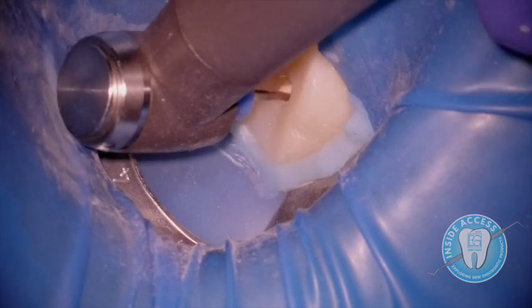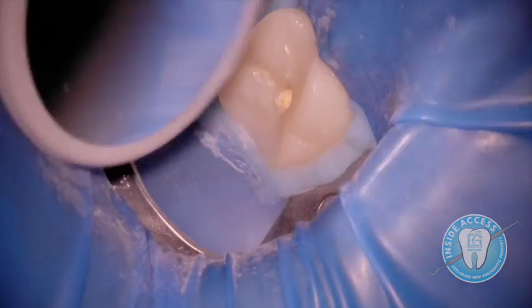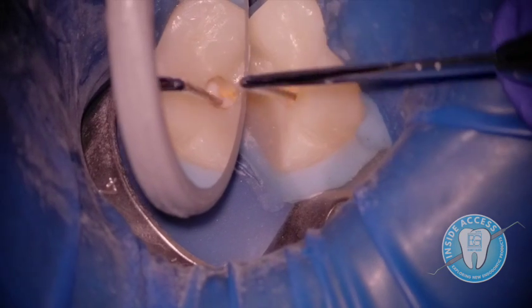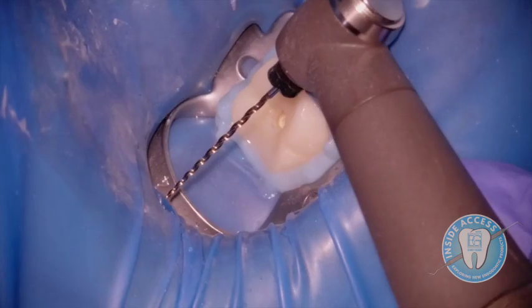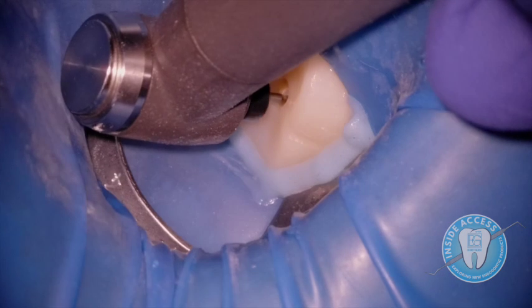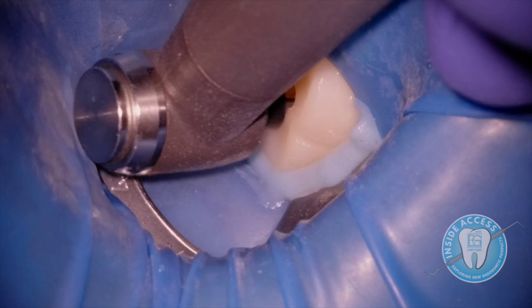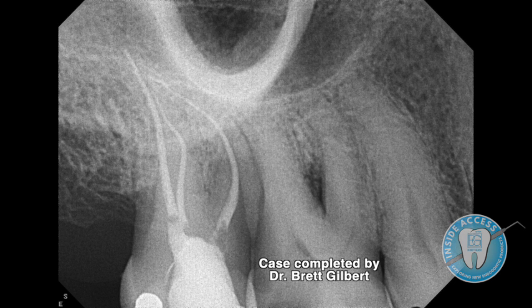Here's F3 at 30/06 — as this one engages I can feel a little more resistance, and when I withdraw you can see it's because it was engaging and removing GP. Always trying to get every bit of GP off the wall. You can see a nice big piece with a corkscrew look as the file winds it out. Finally, F4 at 40/06 — the final shape of the preparation, engaging the apical third. As the case completes, we can see a lateral canal pop of sealer — that lateral canal was likely the cause of the post-treatment disease.